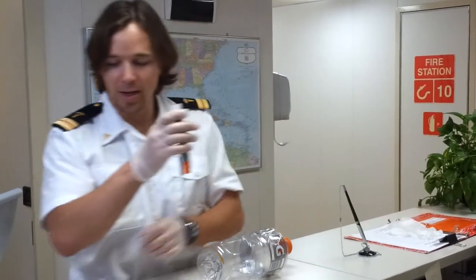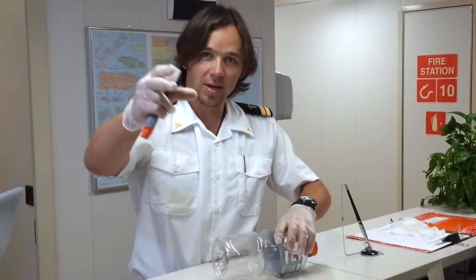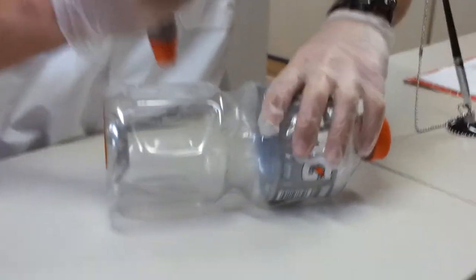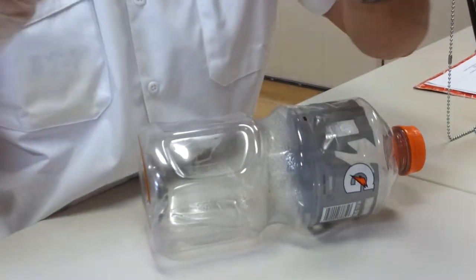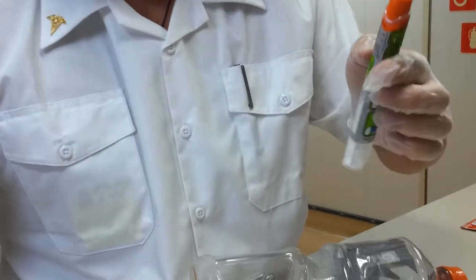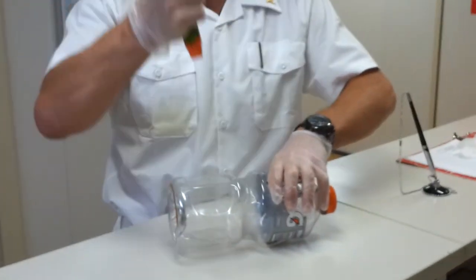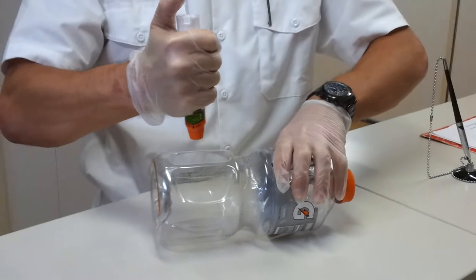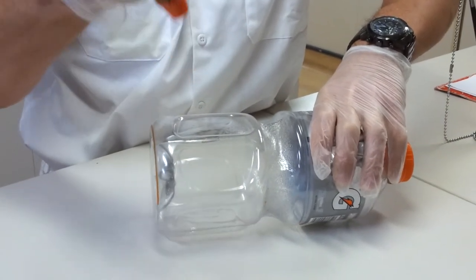If you take it out again and remove the pin, it's ready for action. Come closer so it's visible — we'll actually be able to see the needle in action, how it looks when it goes into the muscle. This device has a spring inside that's going to shoot once we arm it. The idea is to apply pressure on the button, hit it, and hold it for 10 seconds. We'll be able to see how the epinephrine actually goes through the muscle and how the needle stays in the system, which is why we have to hold it for more than a few seconds.